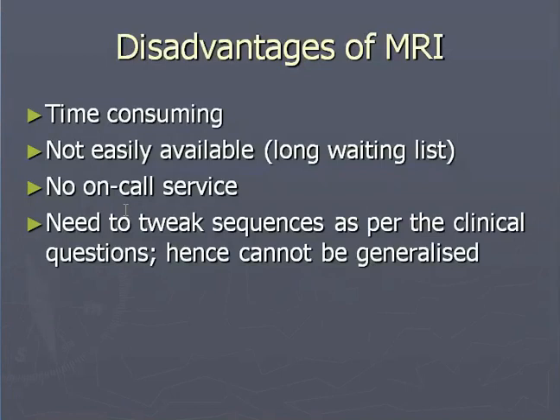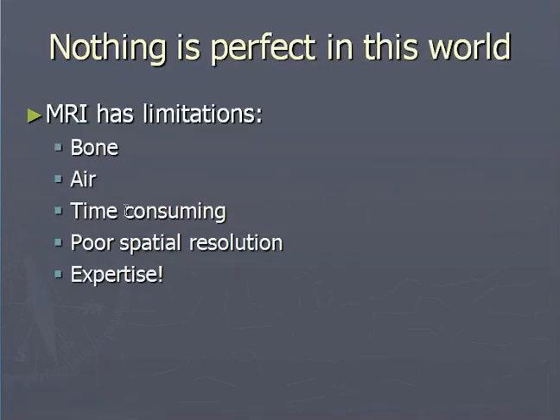Some of the disadvantages: time consuming, not easily available, no on-call service, need to tweak sequences as per the clinical questions, hence cannot be generalized. Nothing is perfect in this world. MRI has limitations, for example bone, air, again time consuming, poor spatial resolution and expertise.